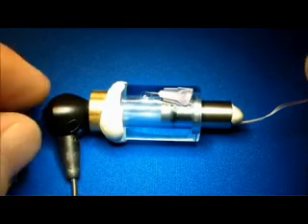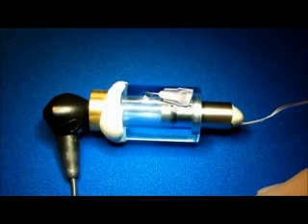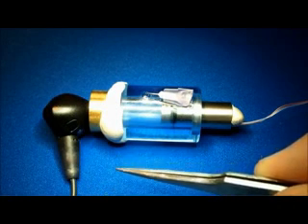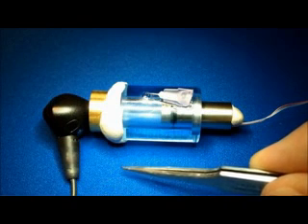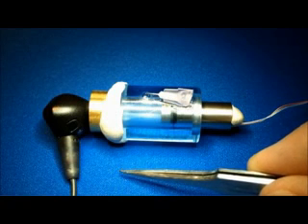Now, for demonstration purposes, I've added a small ring here so that I can connect the receiver to this trapped volume and talk a bit about how the Stapedius reflex measurement is made. The idea is to create a sound pressure disturbance that causes the Stapedius muscle to retract and tend to immobilize the ossicular chain, thus stiffening the tympanic membrane.